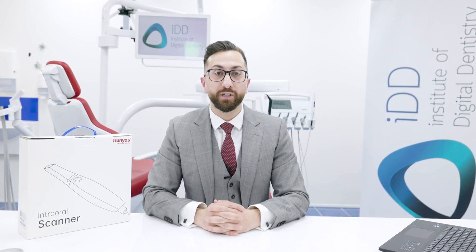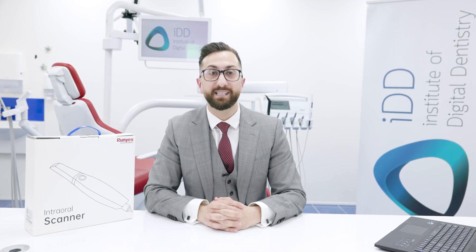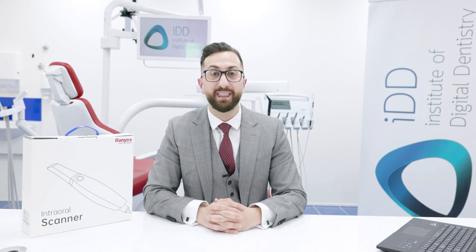It is a Chinese intraoral scanner and one of the most cost-effective options on the market. As we all know, prices of scanners are plummeting — quite something to behold over the past seven years, as today you can get many scanners for under $10,000 USD.